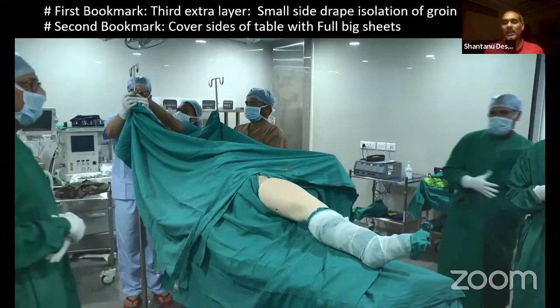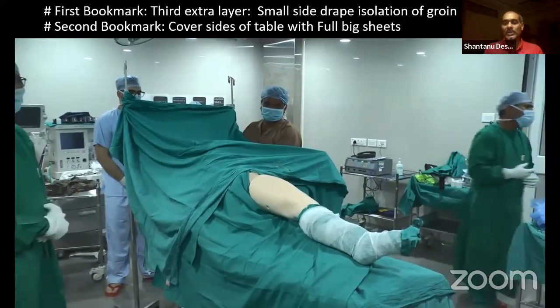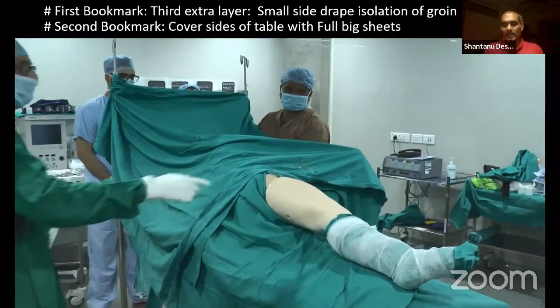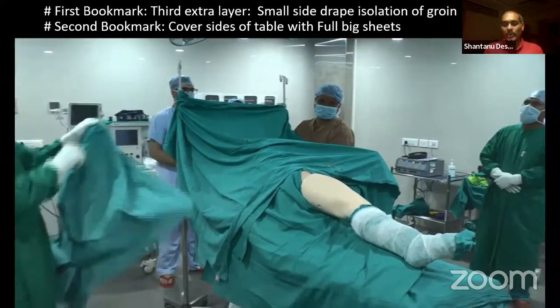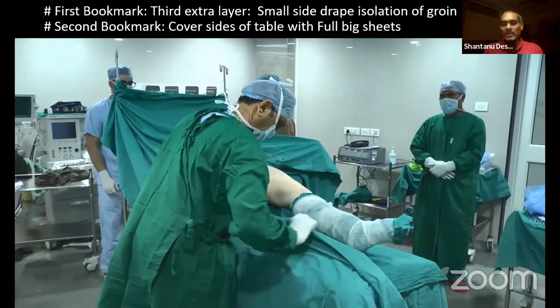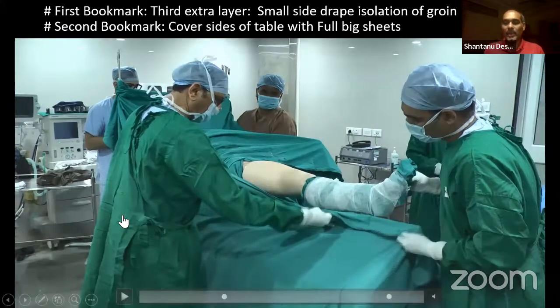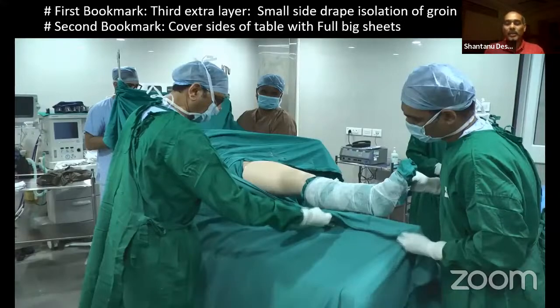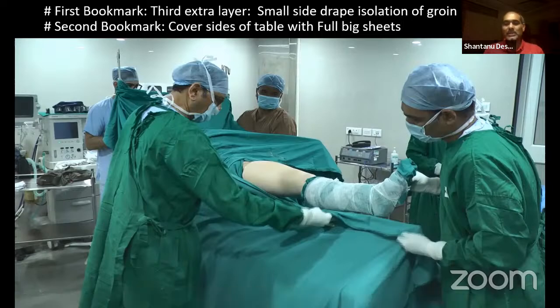If you still have a doubt about where the lower leg is going to come towards the ground when you are going to do a surgical procedure or when you are trying to reduce the hip, that's a stage where an extra drape is used from the edge of the table towards the ground, making sure that during the procedure of reducing the final prosthesis of the hip, we do not want some part of the lower end of the surgical table being open and the foot touching that unsterile zone. So this is an extra precaution for bipolar surgeries, hip replacement, hemiarthroplasties, THR surgeries, that you are making sure that the foot which is going down is not touching an unsterile zone.